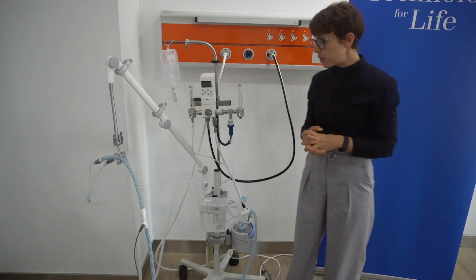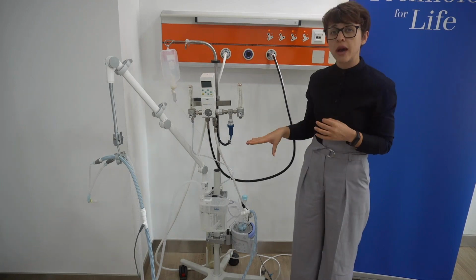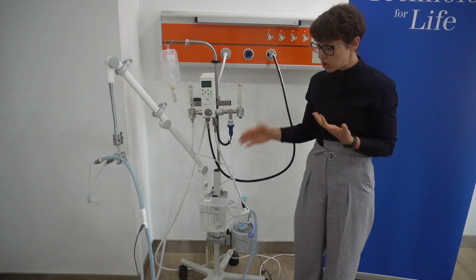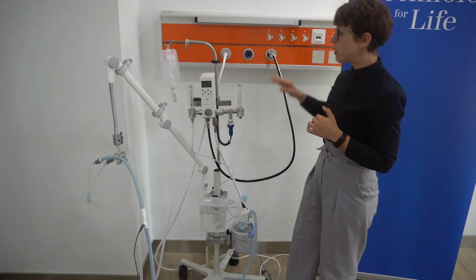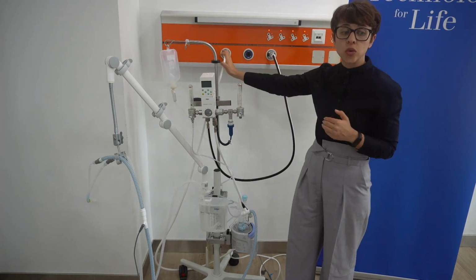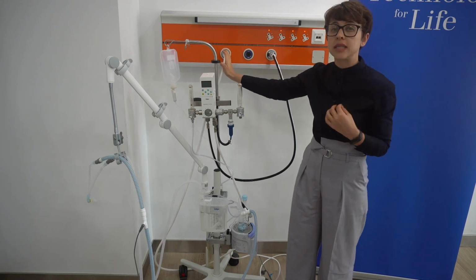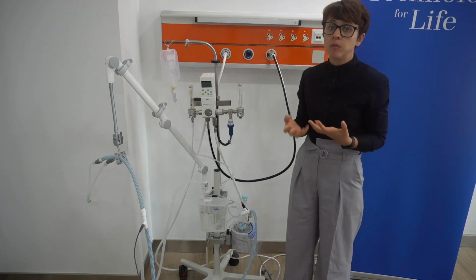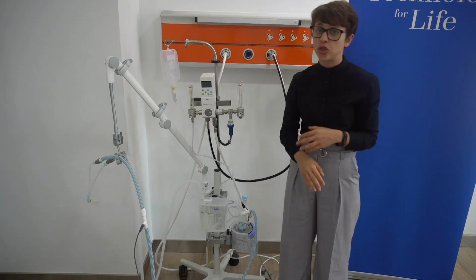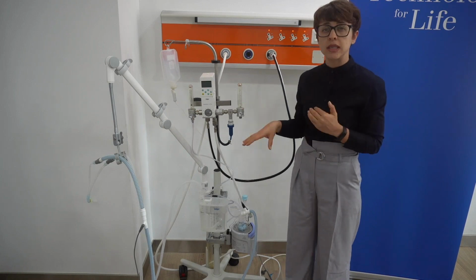So as I mentioned, basically, you don't really need to have the connection to the power. So the Bubble CPAP itself is independent from the power source. The only thing that you do need to have is the gas source. So it can be either a cylinder, it can be a wall supply, but basically that's something to drive the ventilation. Other than that, if you have a cylinder, you can use this system for transport.